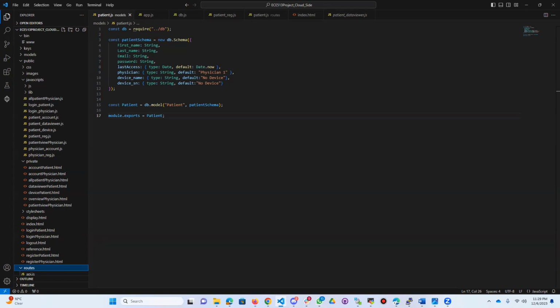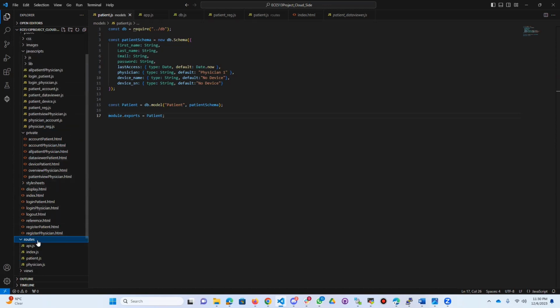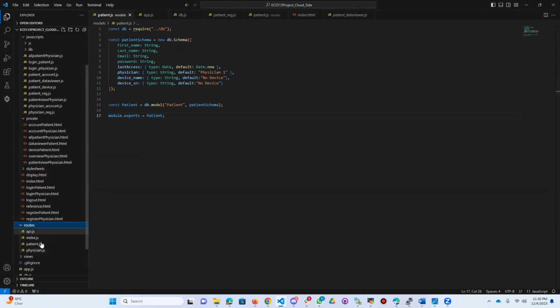The routes folder defines the server-side logic with files like API, index.js, patient.js, and many more. The private folder, as I already said. Okay, so moving to the routes section here. The browser sends the request to the routes, and the server is connected to Express by routes, and what the server does is, after getting the post request or the get request, it interacts with the database and provides the data to the user. And in the routes, we can see three of them, which will come here later.